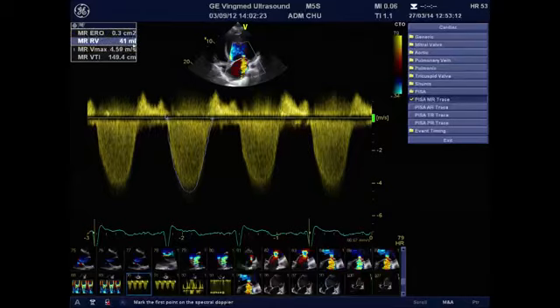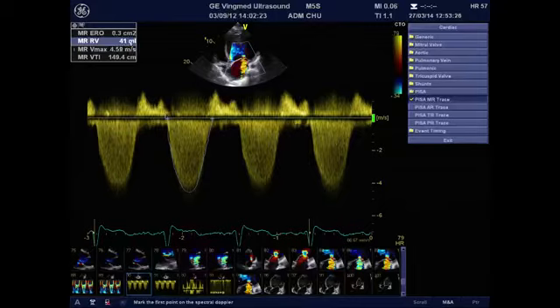So what does it mean? It means that we have a cutoff of intermediate severity of regurgitation according to the guidelines and recommendations, and you know the cutoff is 40 millimeters squared to define severe MR and 60 milliliters to define a regurgitant volume that is also severe.